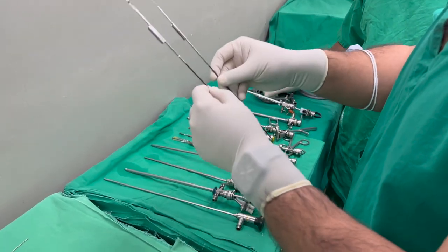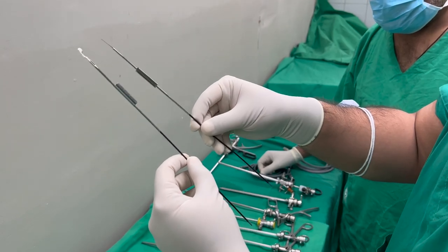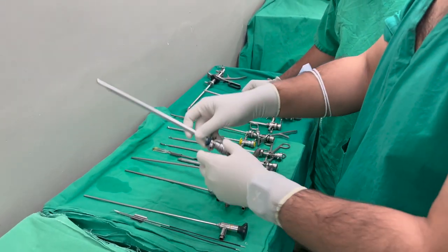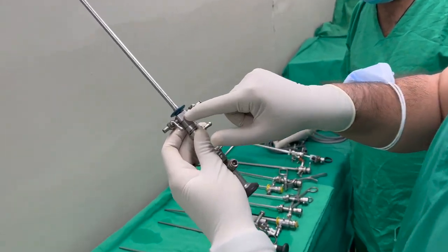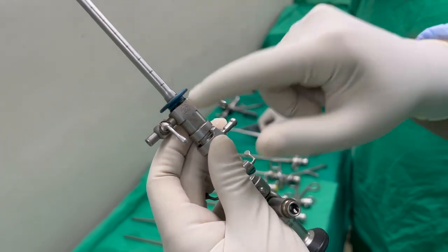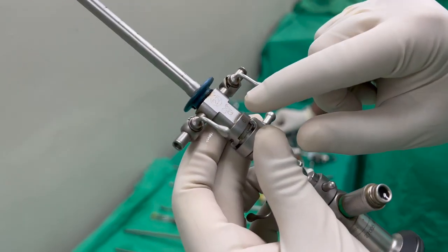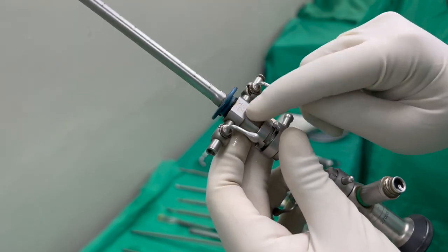We have got a few knives over here which we will assemble and show you later — such as a straight knife, half moon, and full moon. We will tell you about those. This is a cystoscope, and as you can appreciate, this is 22 FR. The 22 tells us that this is a 22 FR sheet and it has got 6 and 8 FR channels through which things can pass.